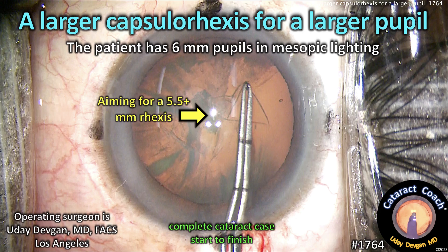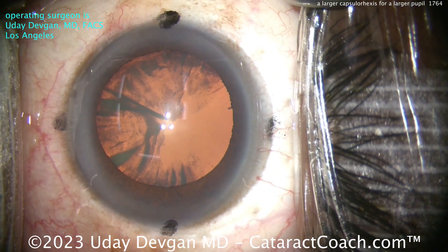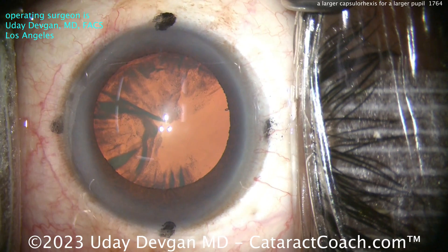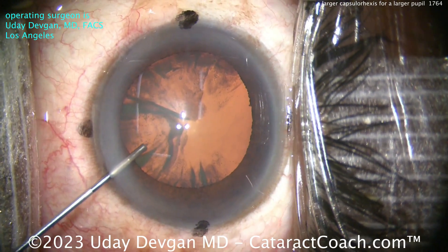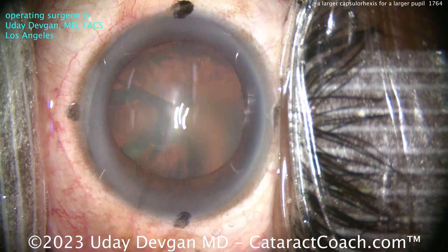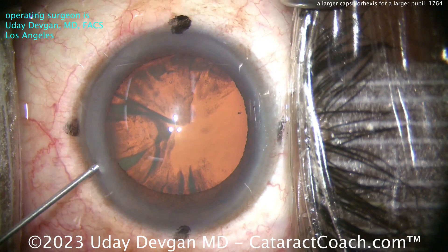A larger capsule rhexis for a larger pupil. This patient has six millimeter pupils in mesopic lighting. Look at that fixation ring compared to the corneal diameter — the white-to-white here is more than 12 millimeters, almost 13 millimeters. So very large white-to-white or corneal diameter, but interestingly not overly myopic. The patient is only about a minus two myope.